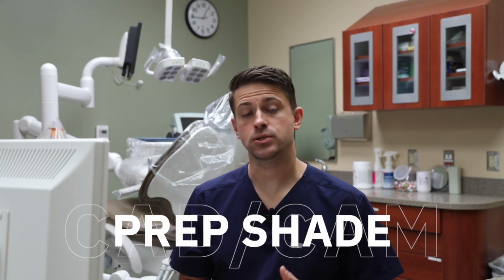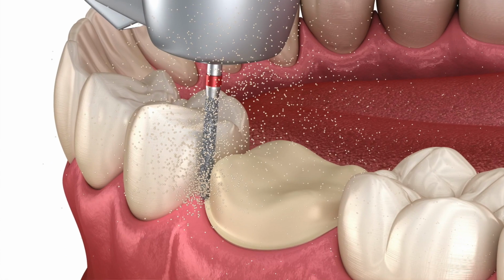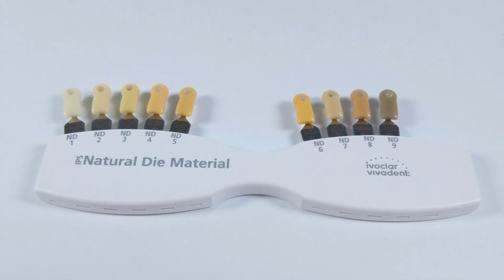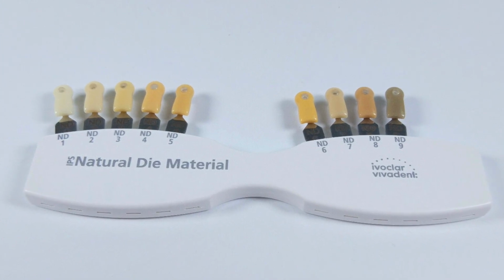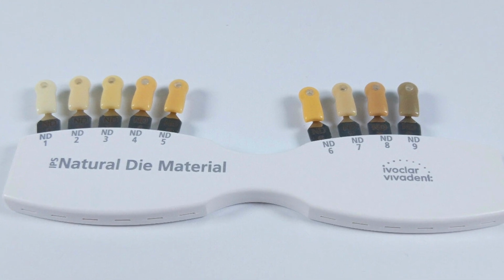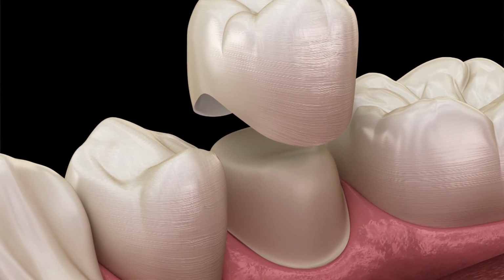There's some things that you have to consider because number one, to make this work, you have to know what the prep shade is, or the stump shade. And to know that, you have to prep the tooth. And then we use a shade guide, the Natural Die Material shade guide, which basically is corresponding to various colors of prep shades. Really, it's kind of various colors of dentin shades, because if you do a full coverage crown, you're prepping away a lot of the enamel, leaving the dentin. So I use that shade guide to confirm basically the color of the prep.